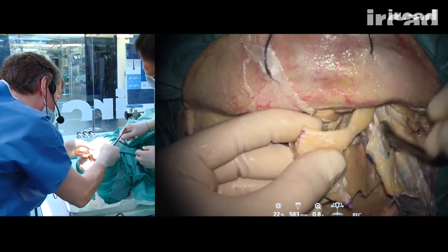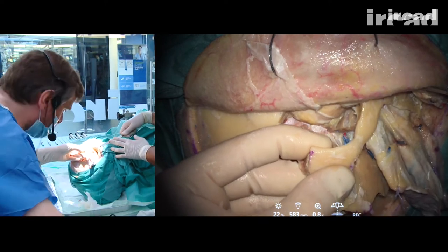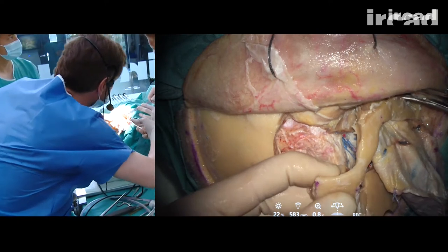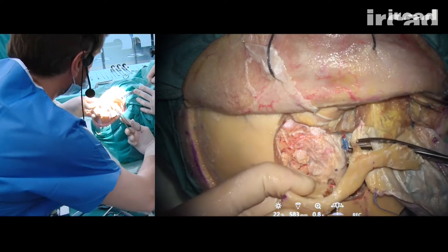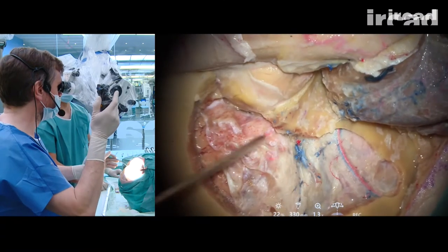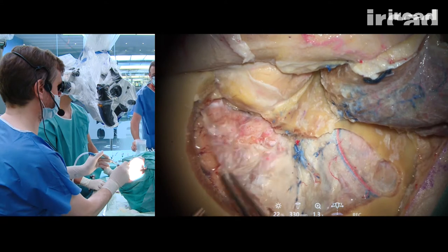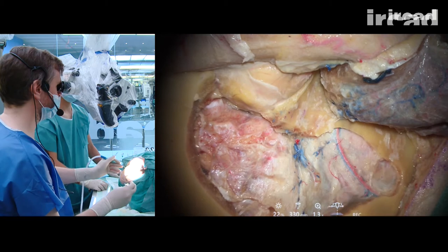OK, tirez un peu là. The final part is a little bit tricky. Last attachment here. Here is the final aspect of the bone flap. OK. So the dura was a little bit disrupted here, but that's okay. I thought it would be worse.